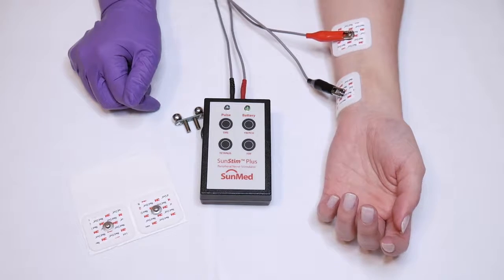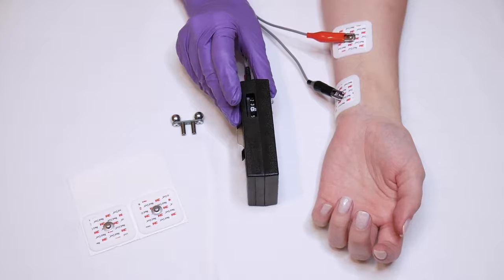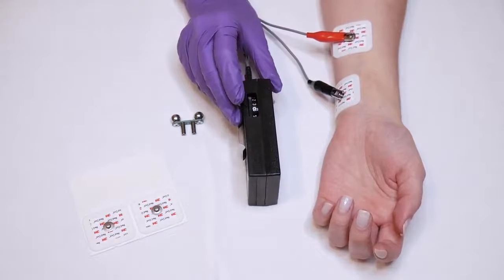In this case, my baseline would be considered number three. You want to make note of that, and for all further assessments, you will refer back to the patient's baseline.